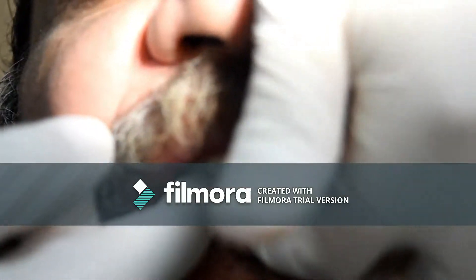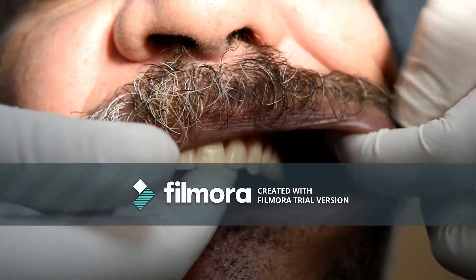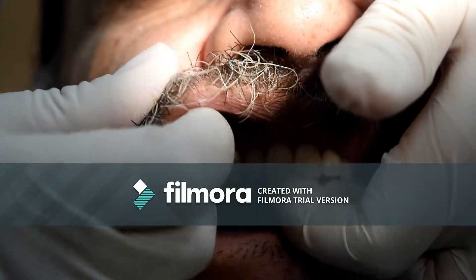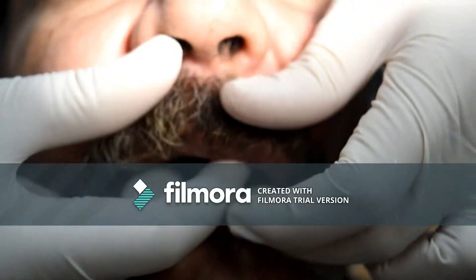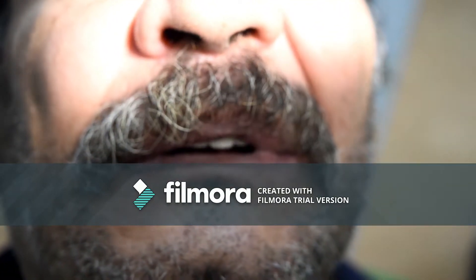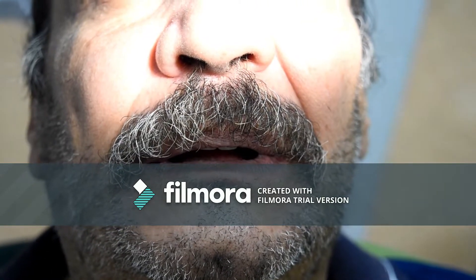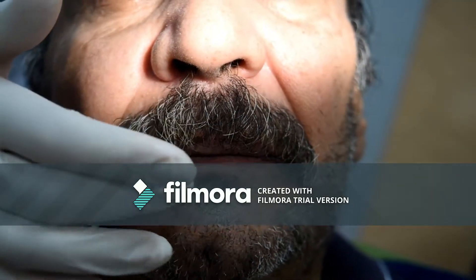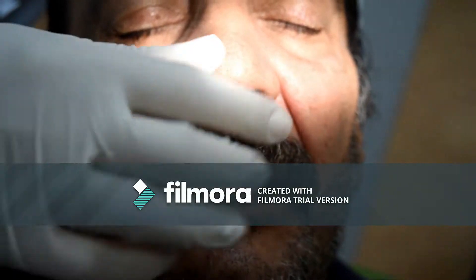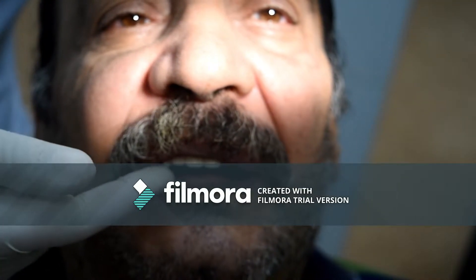All the extensions of the trial denture base should be reaching the functional depth and breadth of the vestibule, anteriorly and posteriorly. If the upper trial denture base is under-extended in the patient's mouth and it is already in its proper length on the cast as already checked, then the secondary impression has to be repeated. After checking the extension, the retention cannot be accurately checked during the trial-in stage as it's not the final denture.